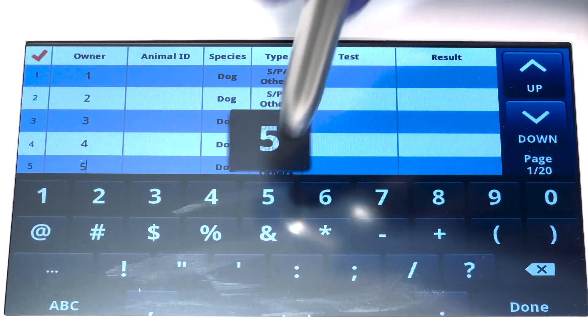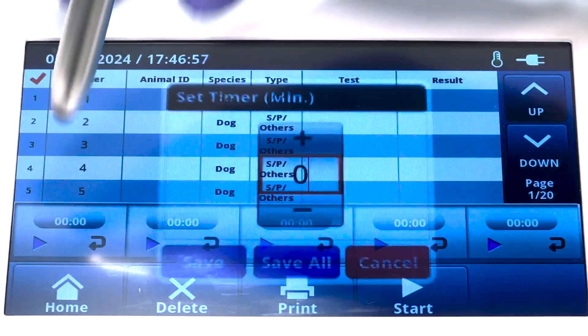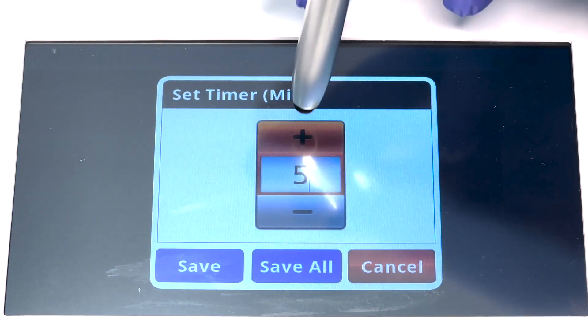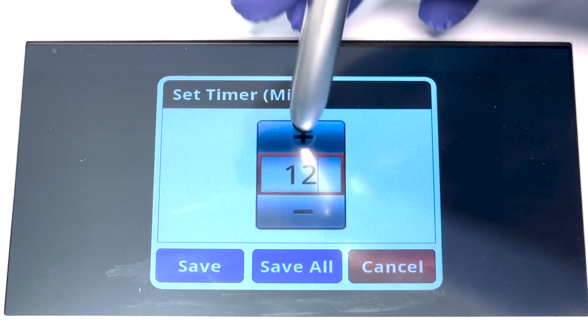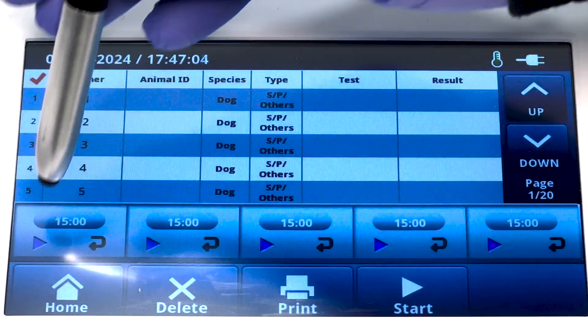When setting your timers on the multi-test option, it's good practice to allow gaps in between timers. You want to allow yourself at least 20 to 30 seconds in between tests to allow yourself time to reset the machine to run the next test strip.